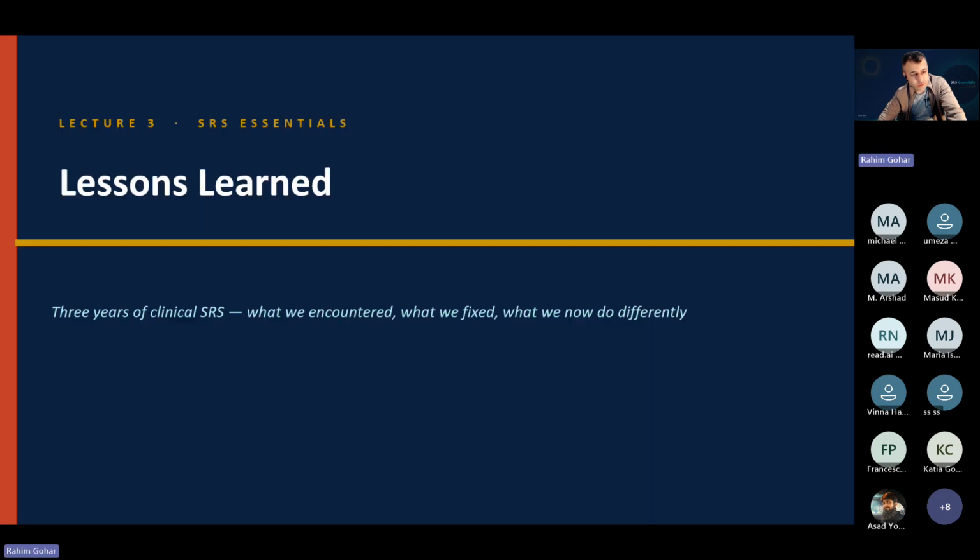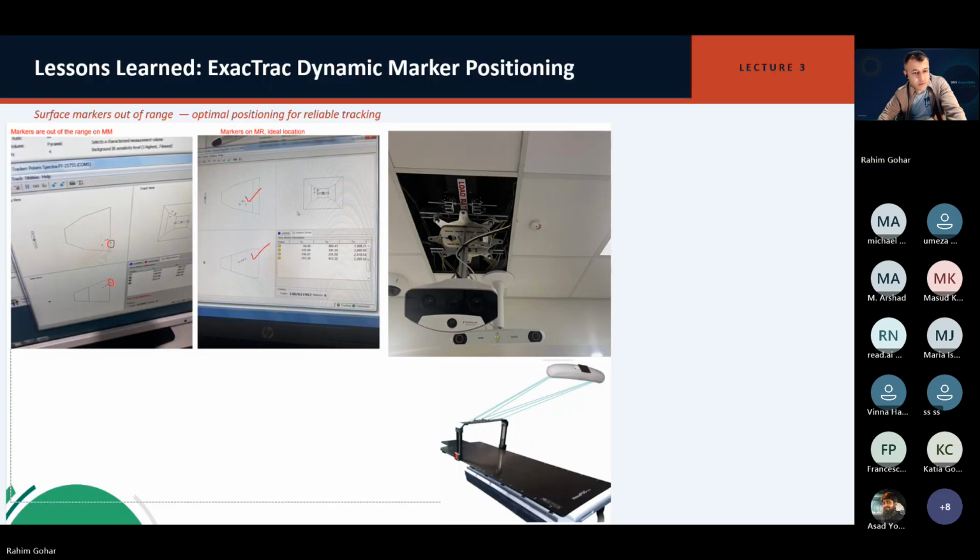So here are some of the lessons we have learned over time, particularly when we started. The first lesson we learned was that if your equipment is not commissioned exactly or in an ideal way, then you may end up having issues.